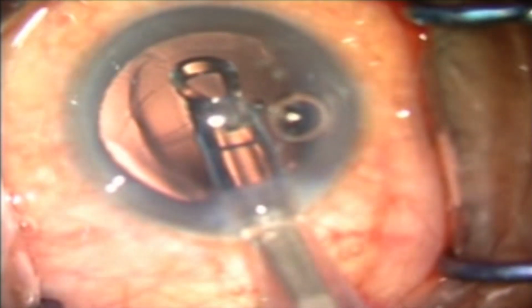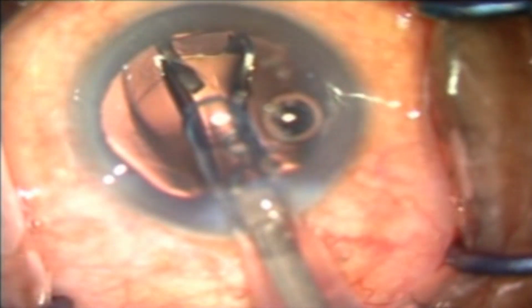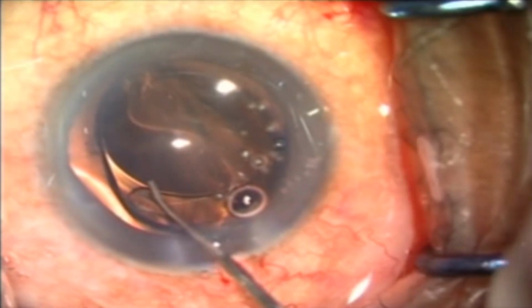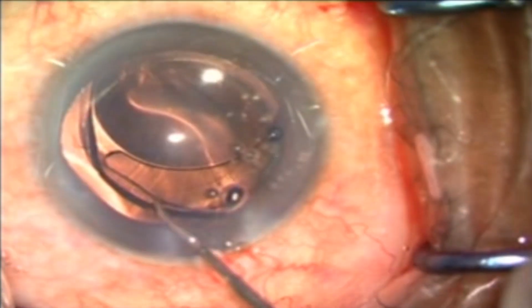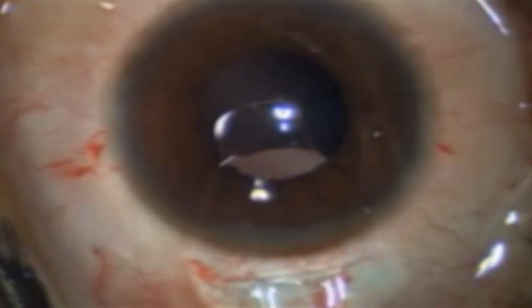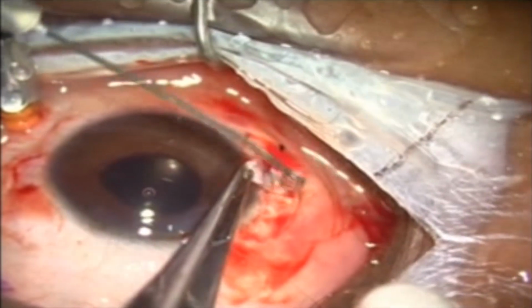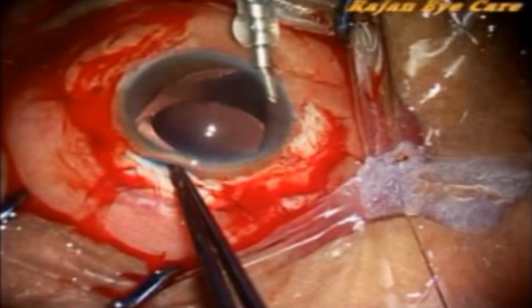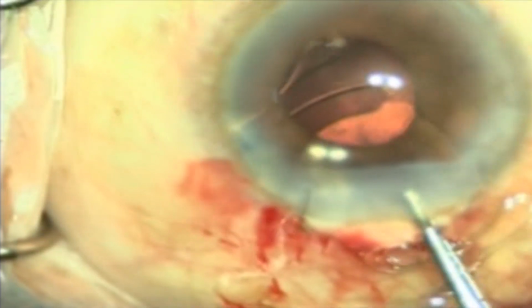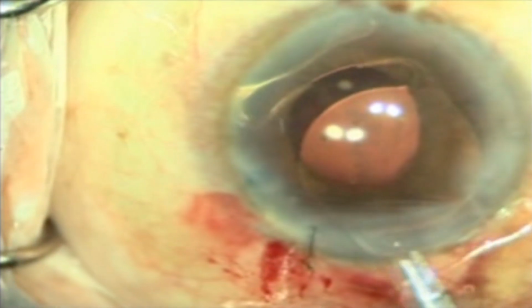Once you have managed the PC tear and the vitreous loss very competently and effectively, then if the PC tear is small, we can go ahead with the single piece lens in the bag. If the PC tear is large, then we have to go in for a multi-piece lens in the sulcus with an optic capture, or go for a retro-iris fixated lens, or a secondary or a primary glued IOL, or a sutured scleral fixation IOL, or even an anterior chamber IOL, making sure a peripheral iridectomy is being done for patients with anterior chamber IOLs.